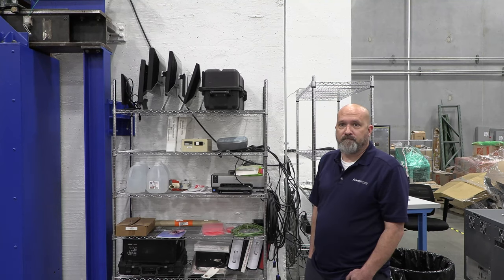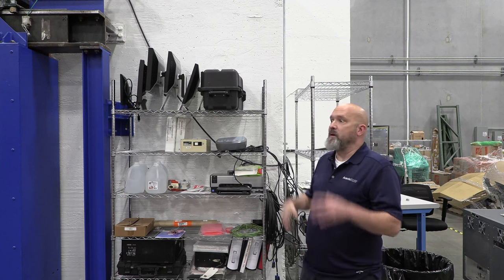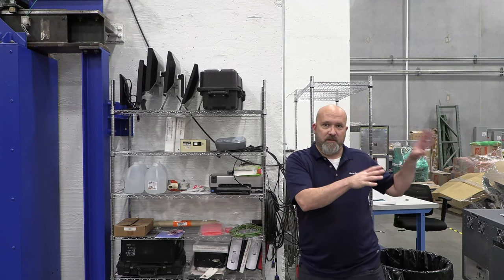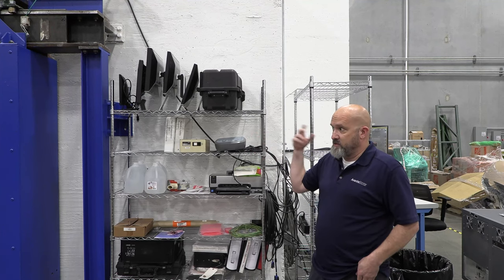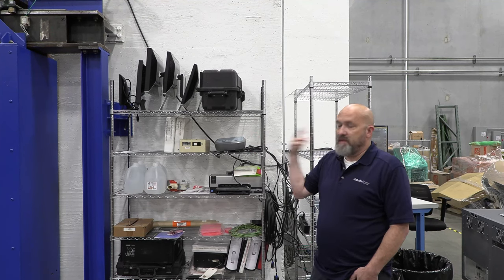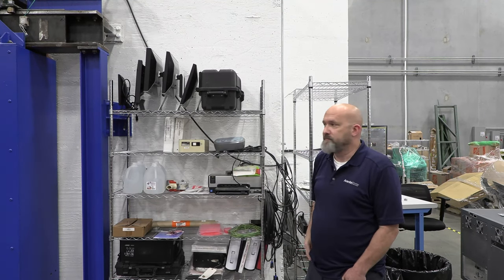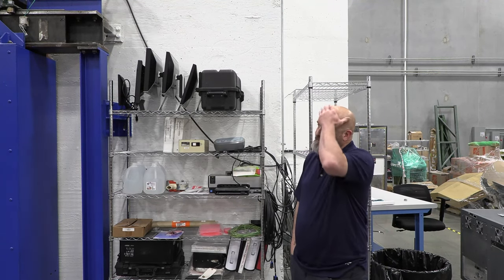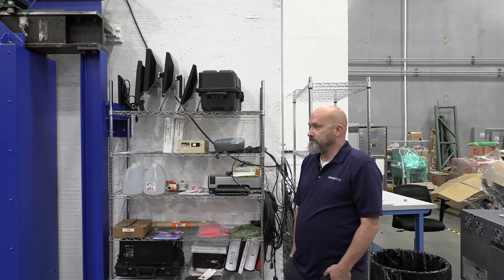Wow, amazing. So this is where they actually do the output tests on the machine? This is where we actually beam on for the big beam. Now we can do KV in all the bays because they're all lead shielded. We have to do the major beam on test in the bunker because it just puts out too much radiation to do anywhere else. That's amazing. That's a very expensive endeavor to build a bunker like this in order to even have that modality. It is.